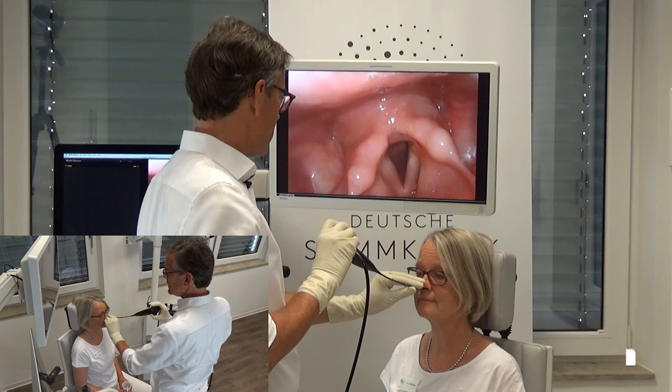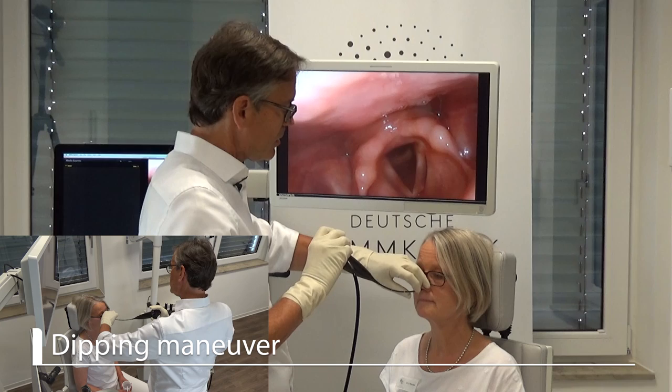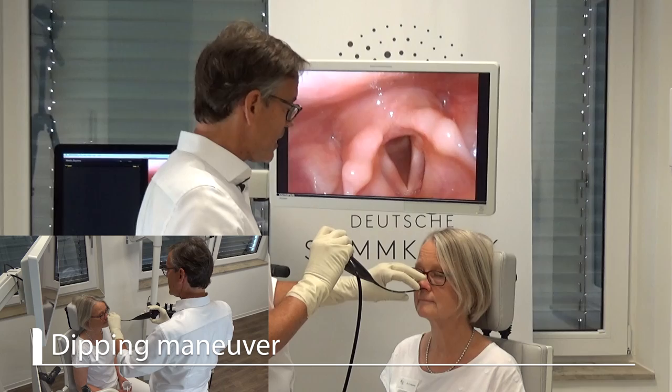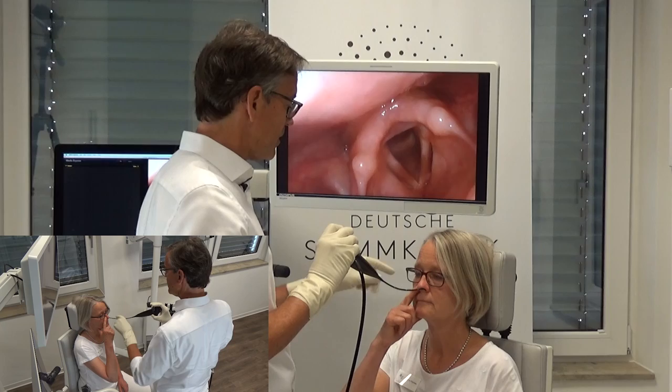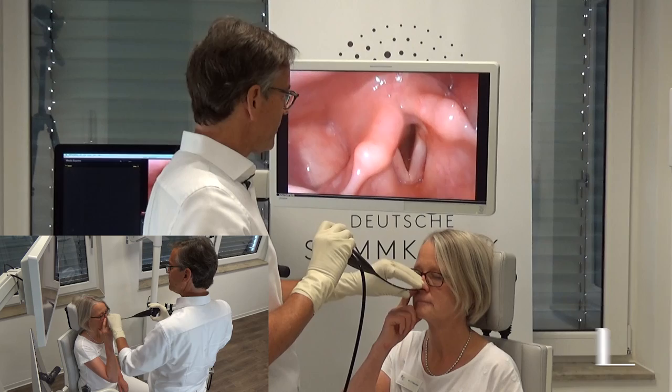Sometimes when you want to do the dipping maneuver, I put the endoscope into the other side, then I can advance the endoscope with my fingers and close the other nostril, or you can ask the patient to use his or her finger to close the nostril on this side or the other side, so that it is easier for you to handle the endoscope. I would ask her to take her finger and close the other nostril. Why do I do that? Because it gives you more resistance for breathing, and a big resistance means that it takes longer to inhale.